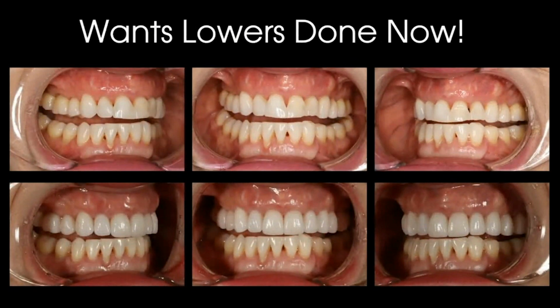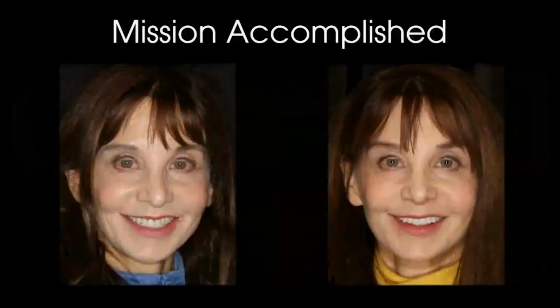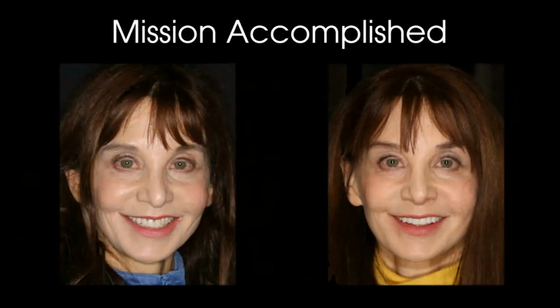She wants her lowers done now, so we're in the process of getting the lowers done to close the black triangles as well. Long connectors, but for a person who's in her late 50s, that's a good result. So there you go.